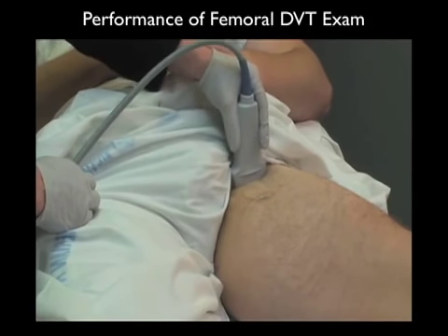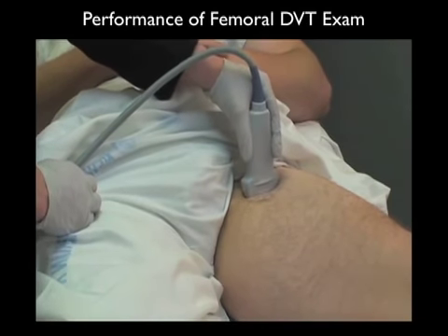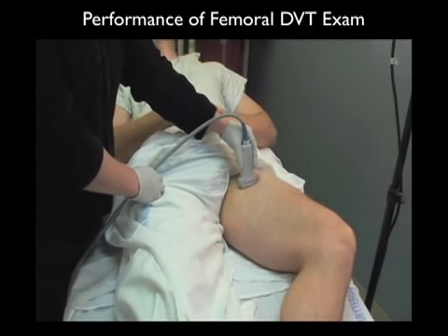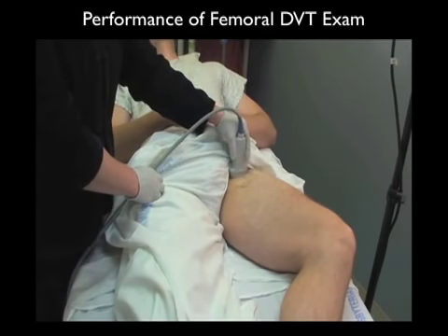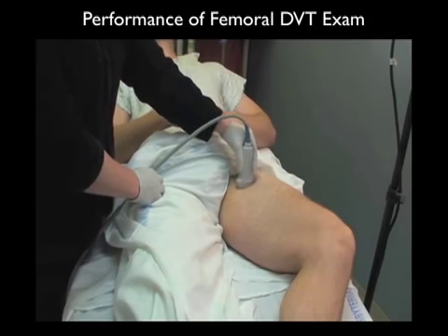Notice that we're compressing down with the probe, and essentially the DVT exam is a compression exam, as a normal vein will completely close with pressure down with the probe. Notice that we're sequentially compressing at different levels along the common femoral vein, compressing from the beginning at the top just below the inguinal ligament, all the way down through bifurcation into the superficial and deep femoral vessels.